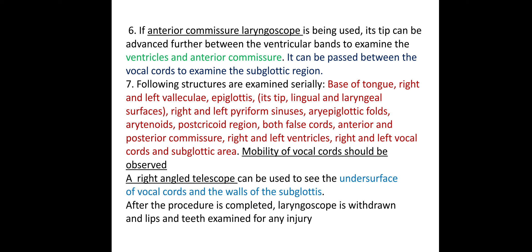The following structures are examined serially: base of tongue, right and left valleculae, epiglottis including its lingual surface, laryngeal surfaces, right and left piriform sinuses, aryepiglottic folds, and arytenoids.